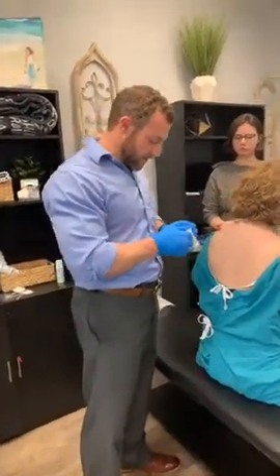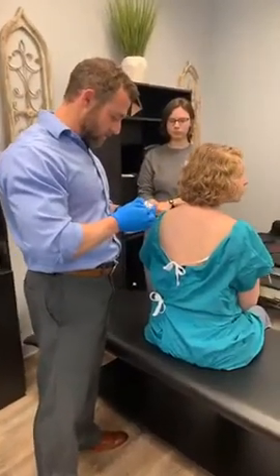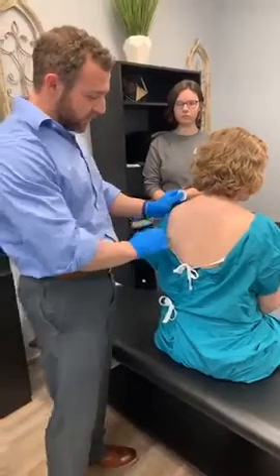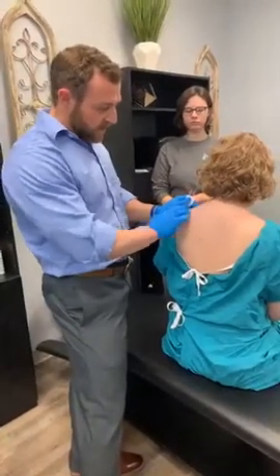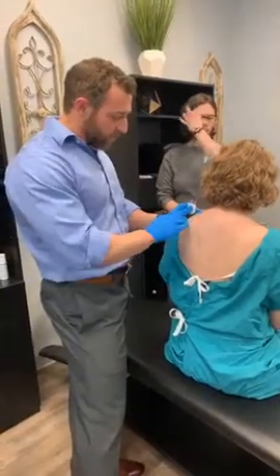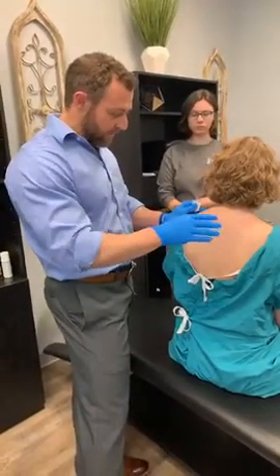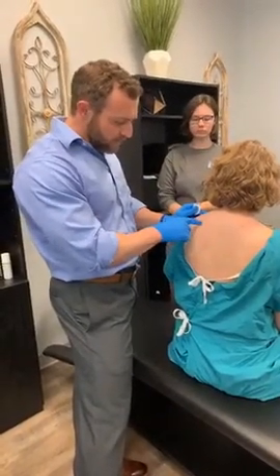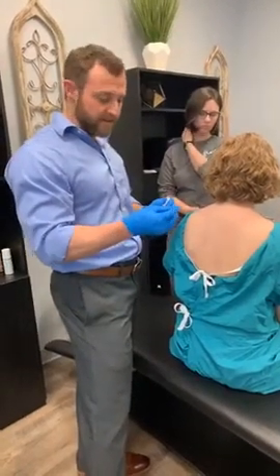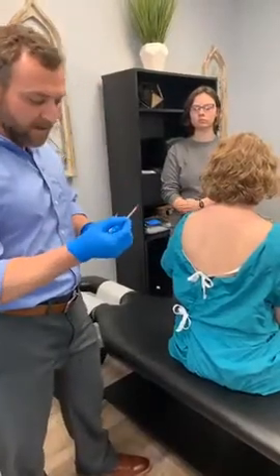So Lindsay here has had a few trigger points, and I've palpated her skin a little bit, so it's a little bit red just from locating a few areas and some knots that we're going to see. First of all, of course, you want to clean the skin and make sure everything's sanitary. Then when you locate your knots, you're using a very thin filiform needle. Now this is an acupuncture needle, and they're very thin.